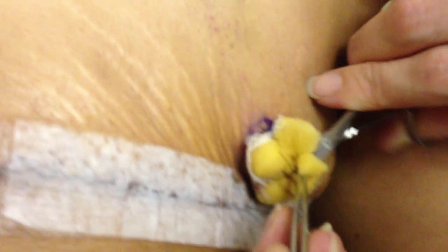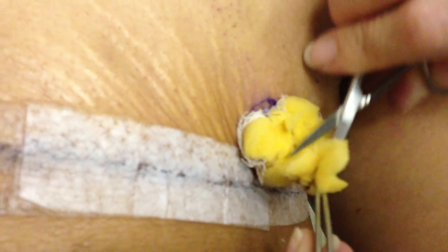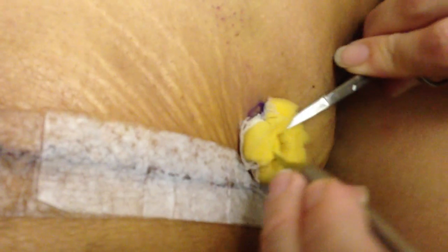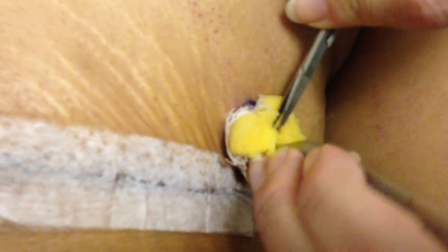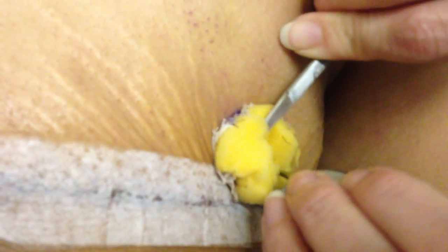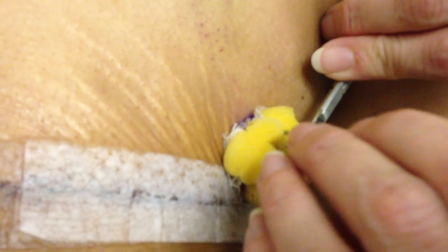So all you have to do is cut right through there. It feels a little weird — it's not painful but there's a little bit of pressure, so sometimes people get a little bit uneasy about that. All I'm doing is cutting through the sponge to release those stitches. I never have to go down to the skin because it's just not necessary.